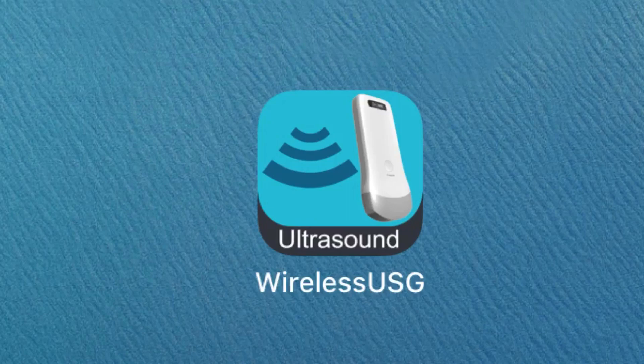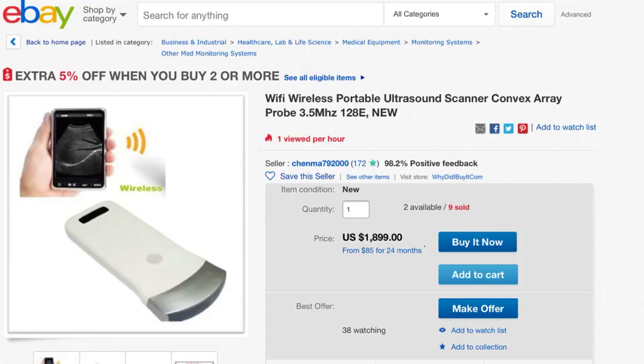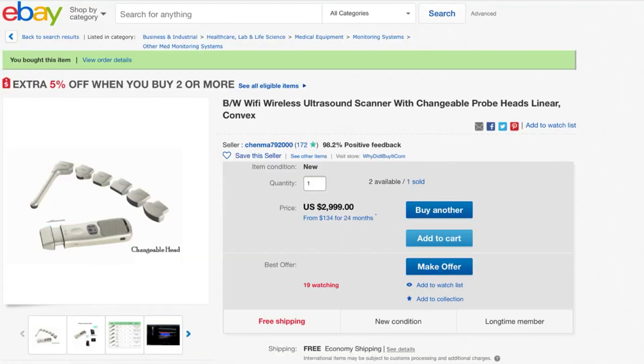Here's the app for the Sonostar probe and the app for the Q-Sono, and the eBay pages I bought them from. My recommendation: buy the Q-Sono. I think you'll be very pleased with it.